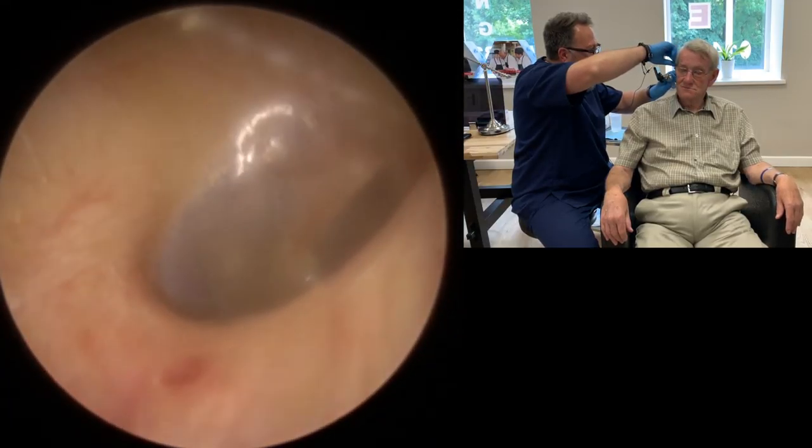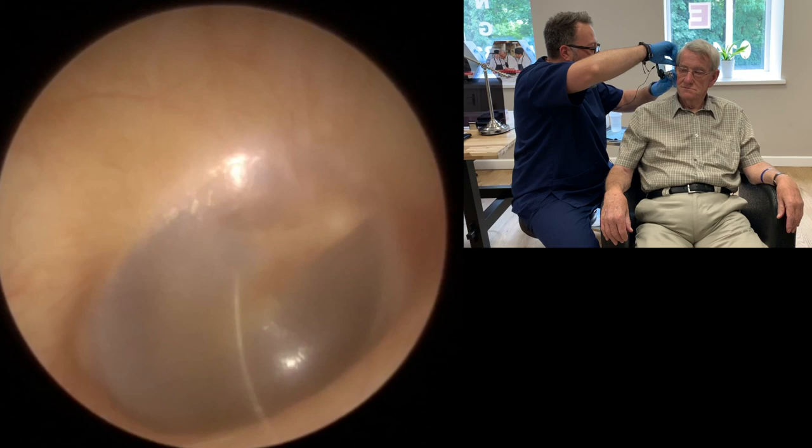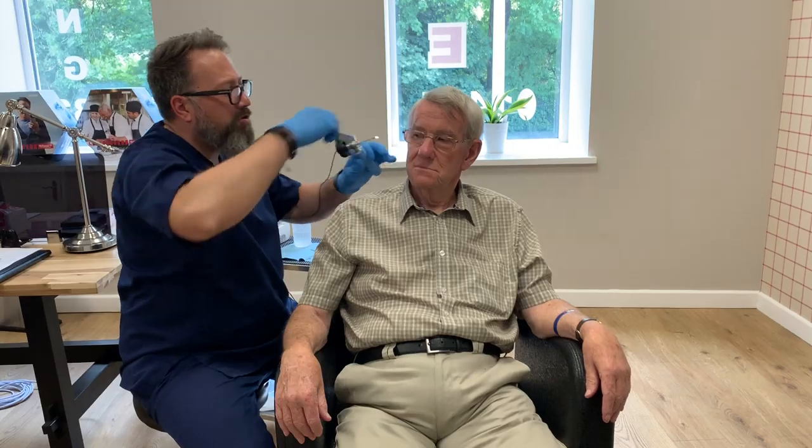And when we go back in to check, there's the eardrum all looking lovely and healthy, really shiny. So very good. Spot on. Really shiny, pearlescent, exactly the way it should be.